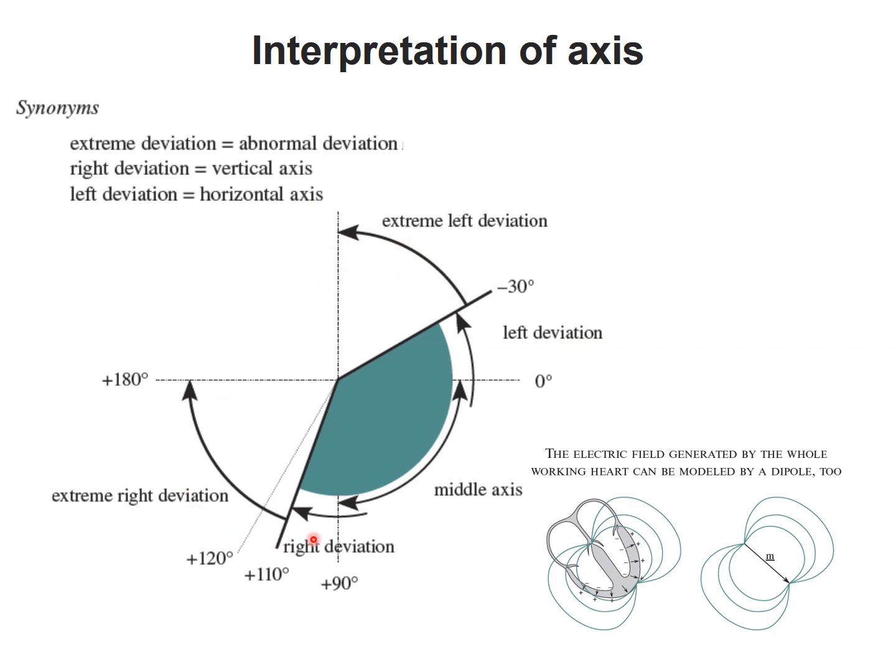If we do have a normal axis, the normal axis ranges from 0 to 90 degrees. Well, that can be explained anatomically, so there is no pathological condition. However, if the main electrical axis is extremely deviated to the left or extremely deviated to the right, for sure there is no anatomic situation that is going to explain this.